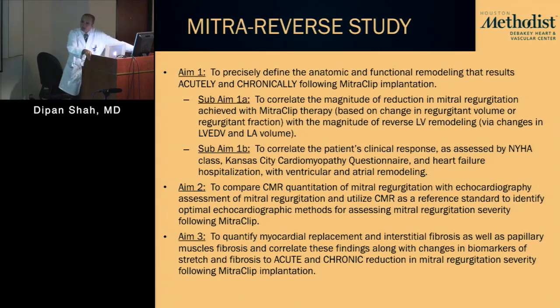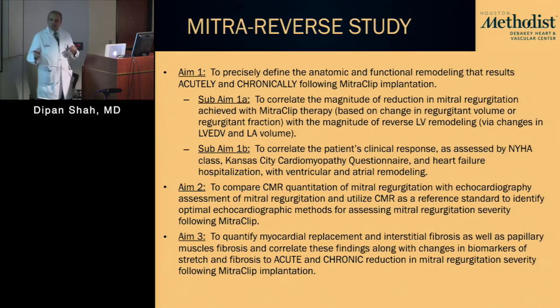Yeah, so we have not done a lot. The challenge is that there was a 9 Tesla scanner in Baylor, and we were working with GERD. The problem is the technique that we use for interstitial fibrosis assessment, for extracellular volume fraction, isn't really available on most of these 9 Tesla scanners for small animal imaging.